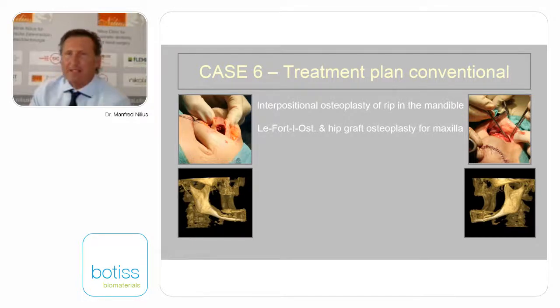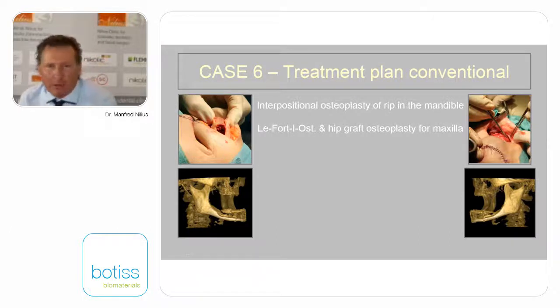Normally people say always. So my patient said, use my rib, and this is the split mandible opened from an extraoral approach, and this is the clinical situation after. There is an X plate to fix it, and you have a D1 bone normally in the mandible, and you have to fill up this gap, and then you have a very good bicortical bone in the mandible.